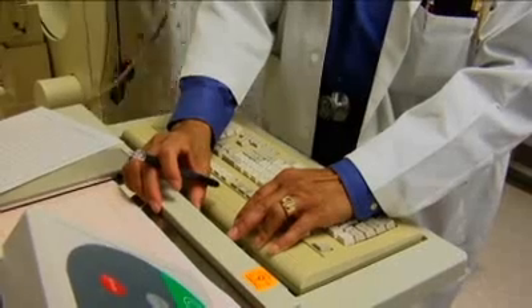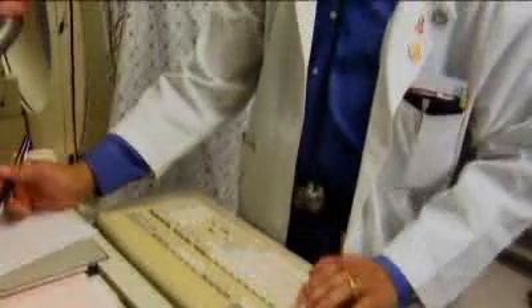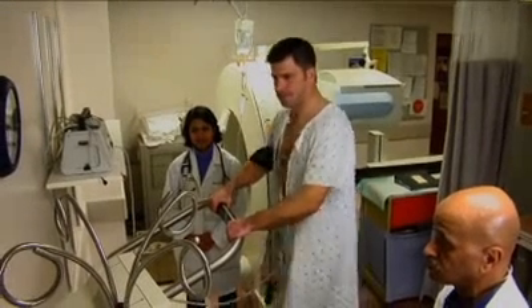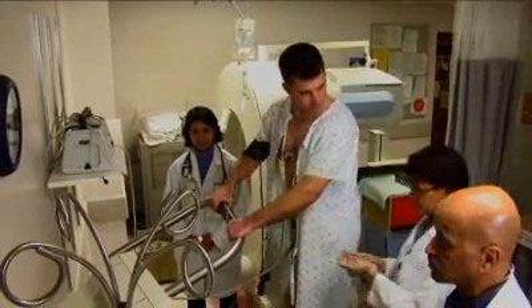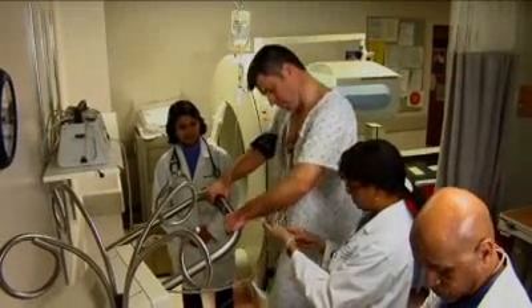When the two tests are combined, an assessment can be made of the status of the blood supply to your heart at rest as well as during stress. This can provide your doctor with information regarding whether or not you have significant blockages in your heart arteries. The test also includes an assessment of the pumping function of your heart.